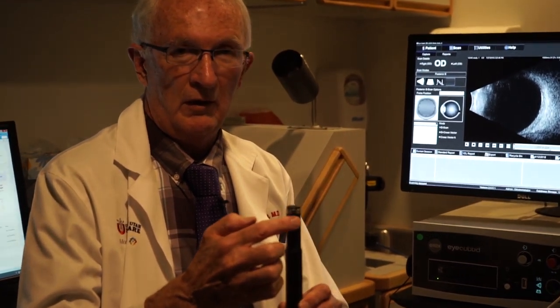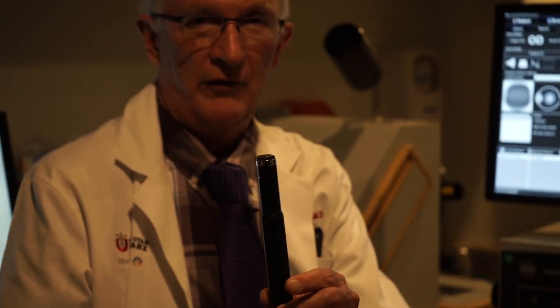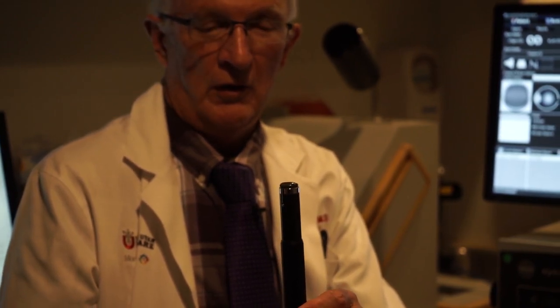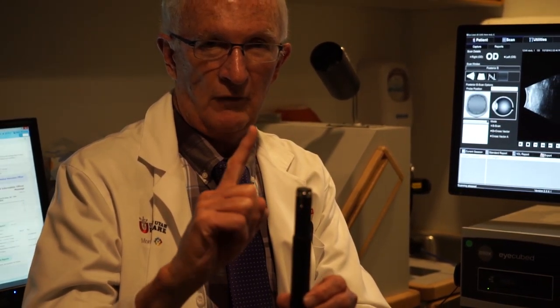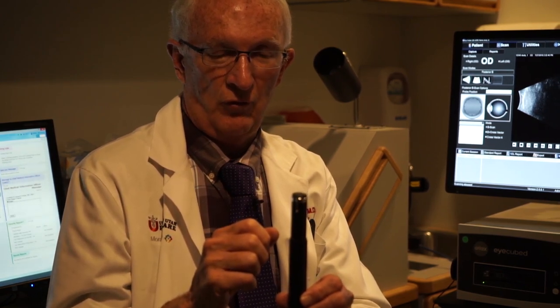The B-scan probes almost all have a little mark on them — in this case it's a little silver streak — and that is there to orient the probe position. When the machine is turned on, there's a transducer inside which oscillates back and forth about 15 to 20 times a second, and that mark indicates the direction of oscillation. This is important for probe position because when looking at different lesions, we need to analyze them in different directions.